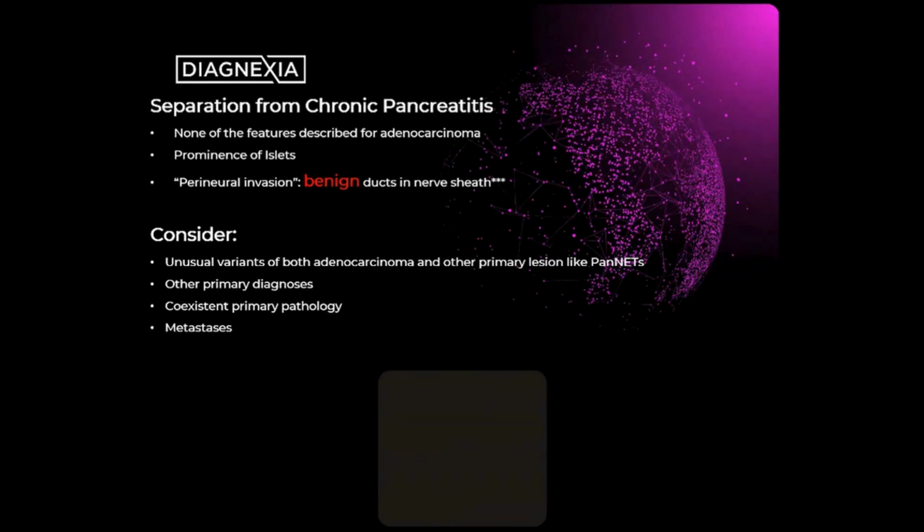And they too can show a degree of hyperplasia and hypertrophy and some nuclear atypia. Again, you generally will have lobules and islets that are well formed, which will separate it from a neuroendocrine tumor. And they vary in size as well. You can get small islets and big islets in the setting of chronic pancreatitis. So again, if there's been no mass present and you see this, then it is reactive surviving islets of Langerhans.